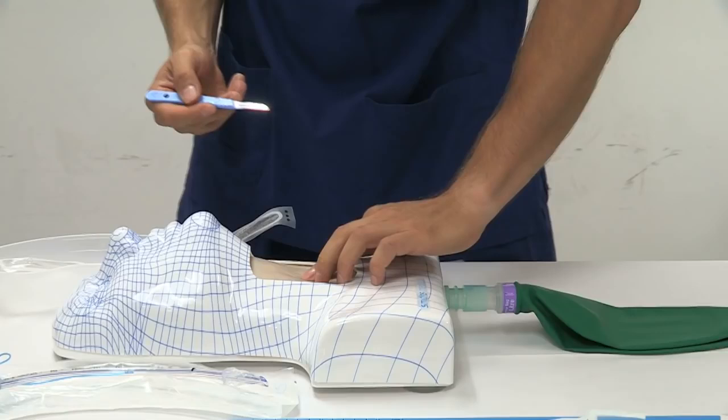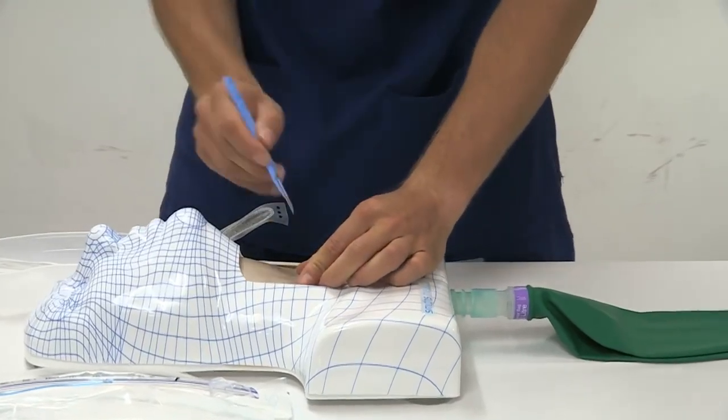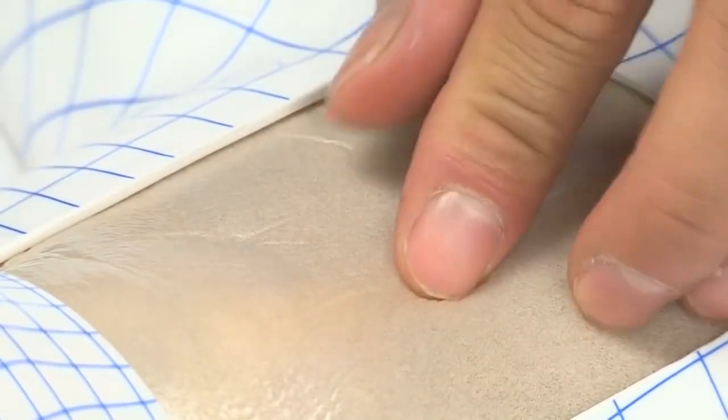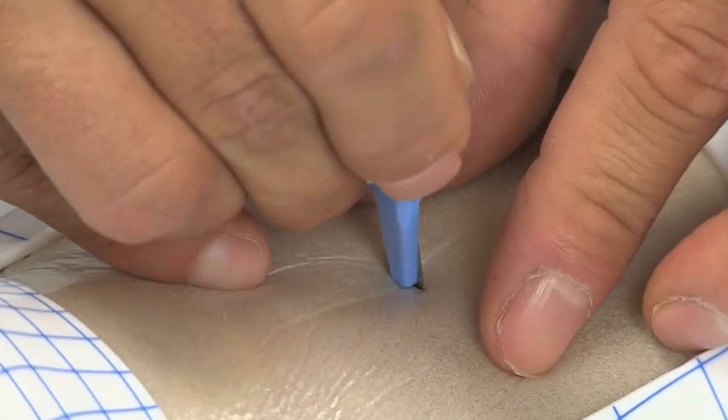When the cricothyroid membrane cannot be identified, the trachea may be used as an alternative location, but only if it is easily palpable. Using the dominant hand, a stab incision is made into the skin and the underlying airway using a size 10 scalpel with the sharp edge towards you.